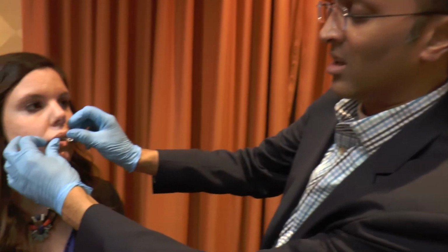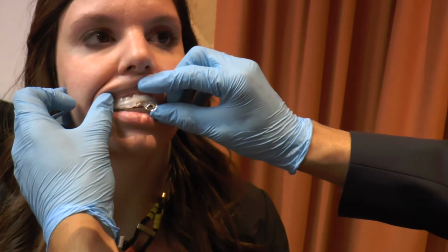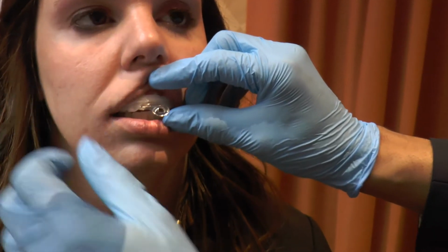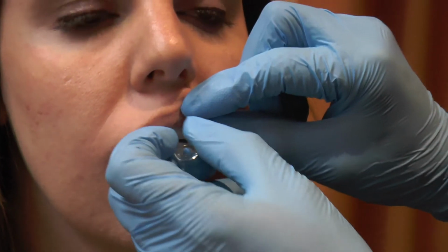So what you want to do is intermittently take a look at this, and make sure that the color converts from clear towards white, as you can see. So it's time for us to gently remove the upper component. Go ahead and open for me.